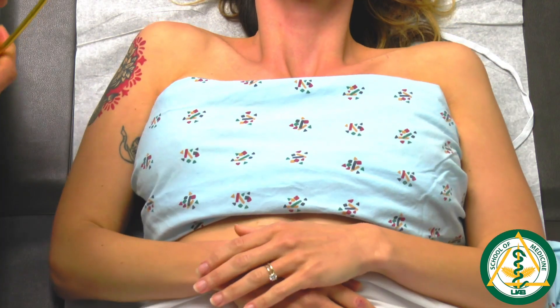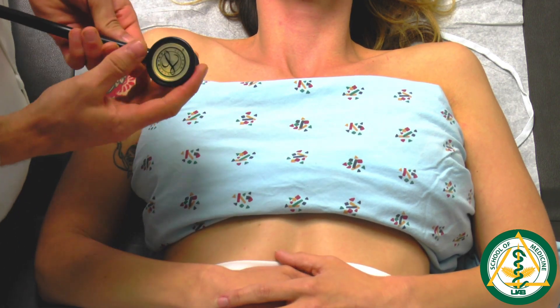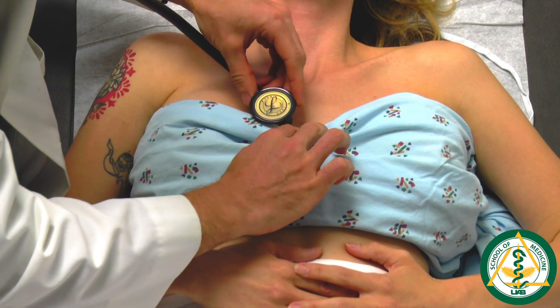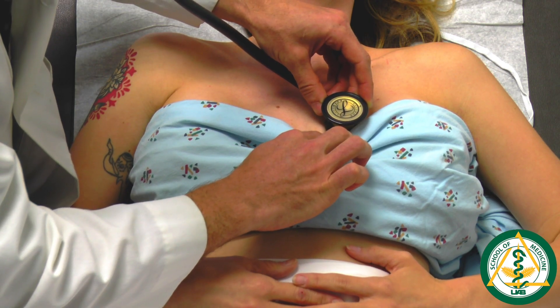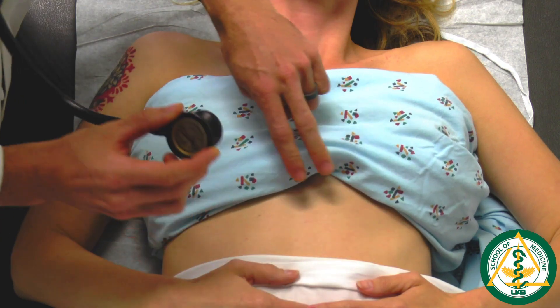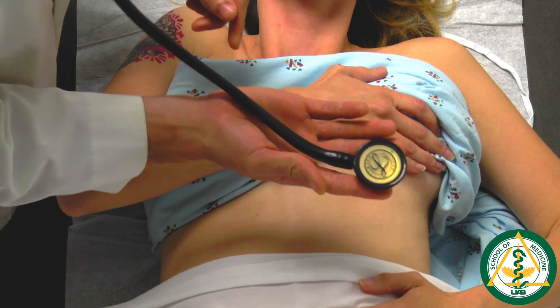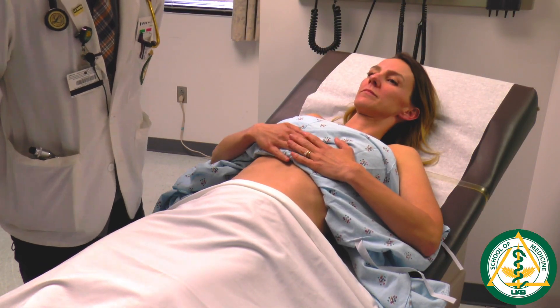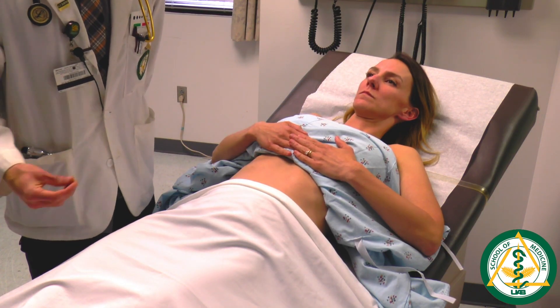Once done palpating, listen in those same areas using the stethoscope with both the bell and diaphragm. Starting at the second intercostal space, listen in the aortic region just to the right of the sternum, then the pulmonic valve region just to the left. Course down to the fifth intercostal space on the left of the sternum for the tricuspid area, then listen at the PMI for the mitral valve. Repeat using the diaphragm in those same four locations. If having difficulty finding the PMI, rotate the patient onto their left side to bring the heart against the chest wall.